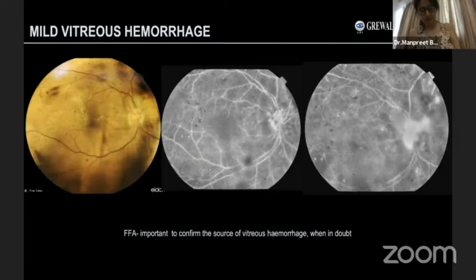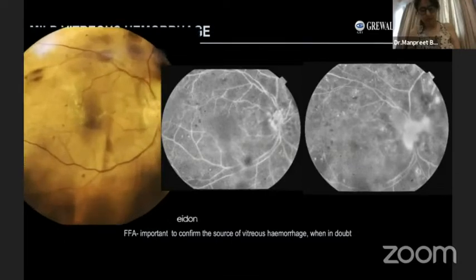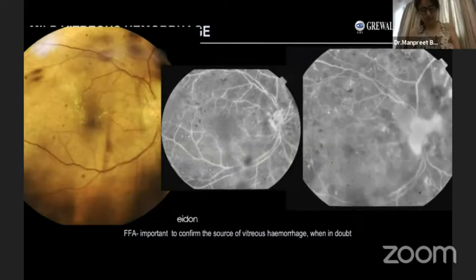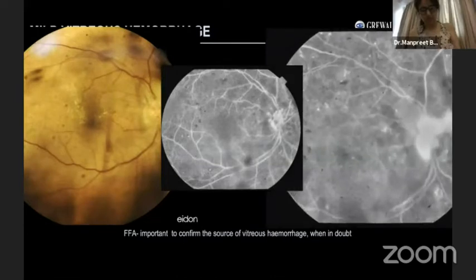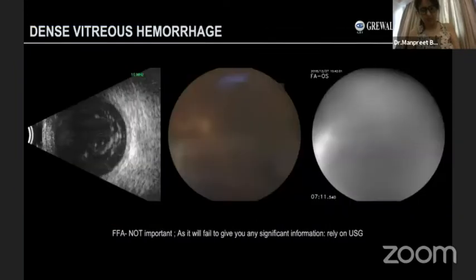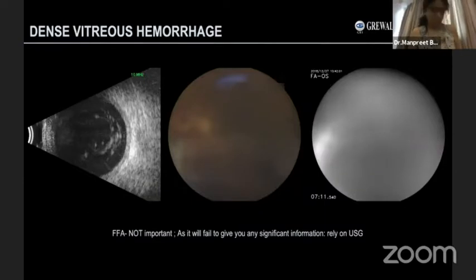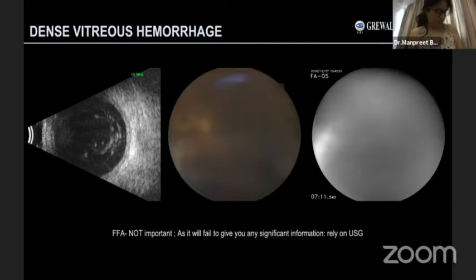Here, the fundus depicts mild vitreous bleed. The fluorescein angiogram in the early and late phase picks up an NVD at the disc which is more than one-fourth disc area, confirming this as a case of PDR. However, in case of dense vitreous hemorrhage, fluorescein angiogram is not important as it will fail to give any significant information.